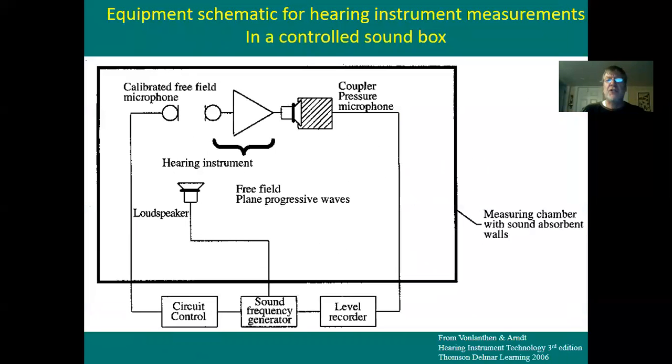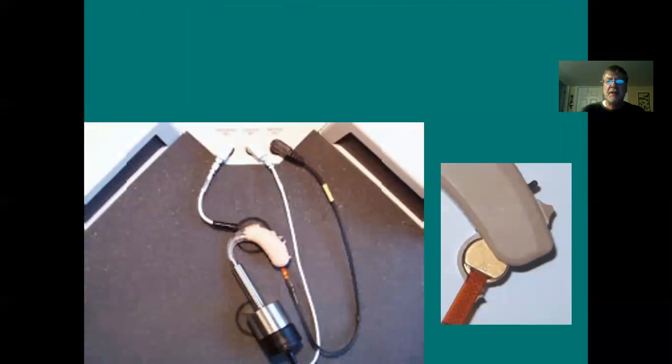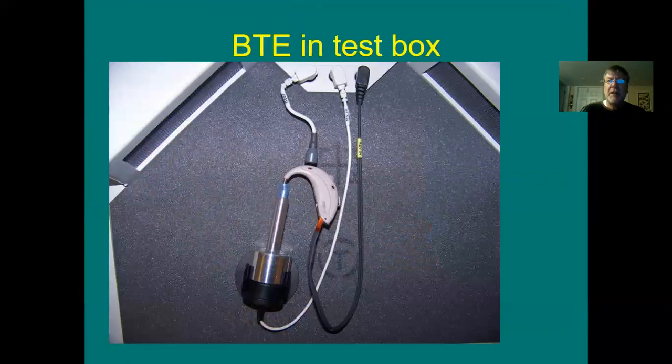This next picture is boring, so don't look at it, okay? So here's an actual photograph of a BTE with its ear hook connected to the coupler. Here's your coupler. Here's your measurement microphone. Here's that reference mic, making sure that the speakers, here's one speaker here, here's another speaker here, are all behaving, okay? BTE in the test box, another picture showing you the same thing.